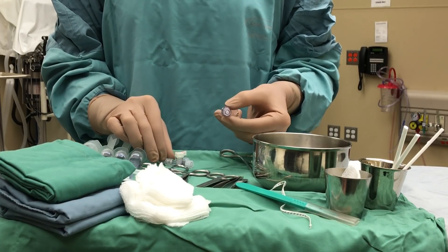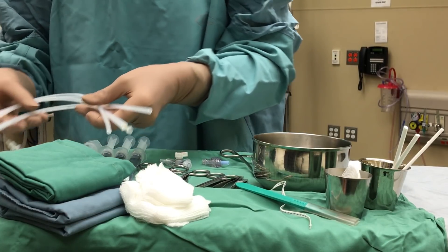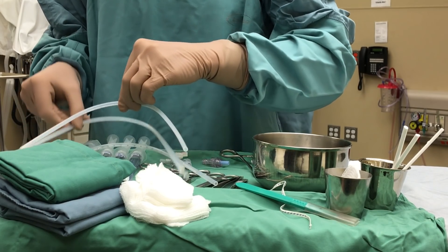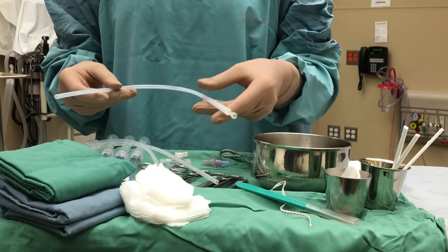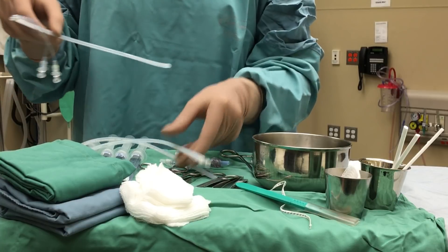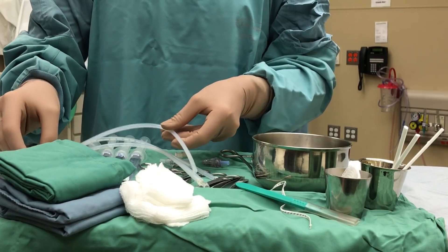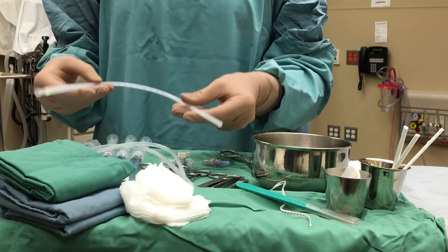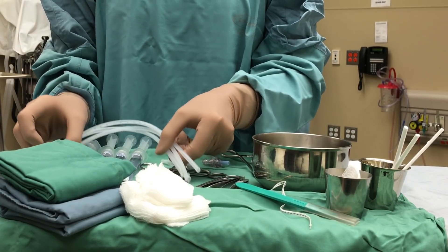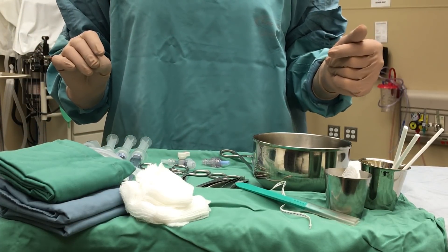Now we can move on to our catheters. There are various umbilical catheter sizes. What we use in neonates is most often a 3.5 French Argyle — it is a single lumen, and it also comes in a 3.5 double lumen catheter, most often used in our more critical patients for UVC insertion. We also have a number 5 French single lumen umbilical catheter, which is often used in our bigger babies who are greater than 2.5 kilos.